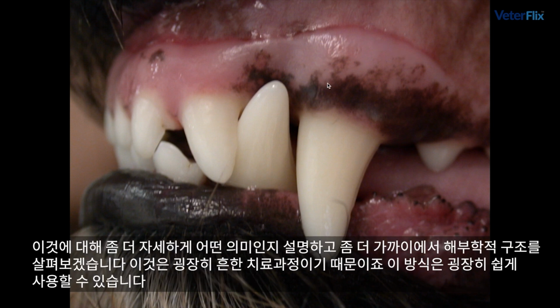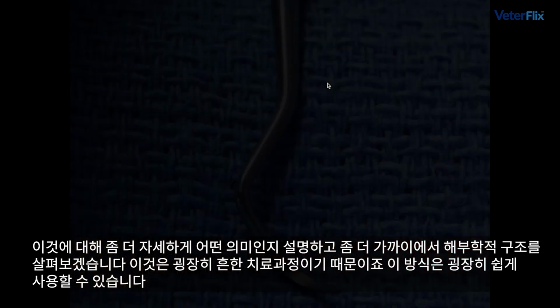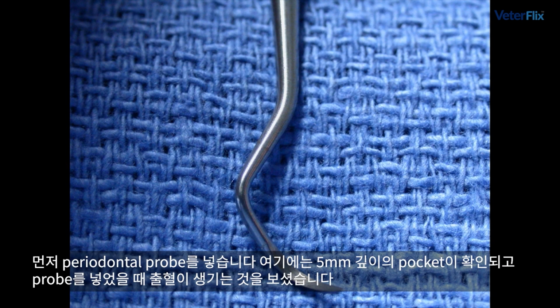So we'll walk you through that and show you exactly what we mean, and look at the anatomy a little closer here, because this is a very common procedure that's very commonly misused. So we place a periodontal probe. We have a 5mm pocket in that area that I just showed you. It bleeds when it's probed.